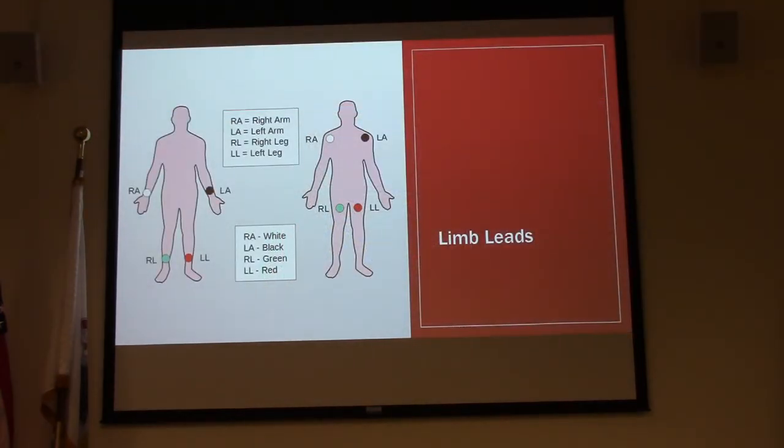So when you run a 12 lead on somebody, and I'm not just talking about putting the monitor on with 4 leads and doing a quick rhythm check, where do you put your limb leads? Do you put them right here in the thoracic area? Most of you do, because that's what you've been taught to do for so long, right? Some of you put them where? Very good. They're limb leads for a reason, right?